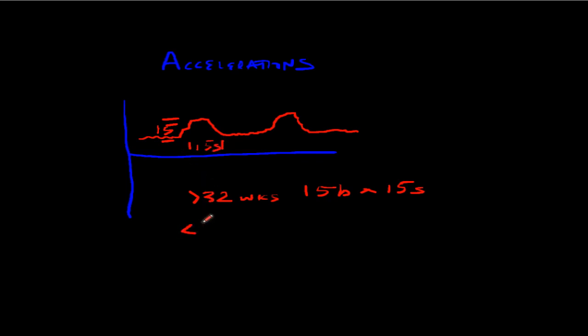If we're less than 32 weeks gestation, we'll take 10 beats for 10 seconds. But again, accelerations are increases. It's generally a favorable positive response, and that's something that we find very reassuring.